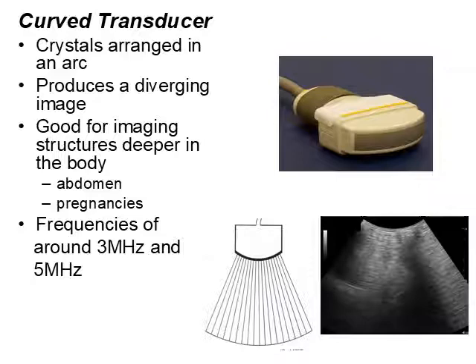However, on any adult, I'm going to need to use the 3 megahertz transducer to get the depth. And as I say, if you think about yourself anterior to posterior, if I want to scan the liver, which takes up the whole of your right upper quadrant of your abdomen, to get from the front to the back, we need the 3 megahertz transducer. In an adult, you just won't see to the back of the liver with a 5. If you're not seeing it well, you could miss a pathology. So they're the two most common transducers that you're going to come across.